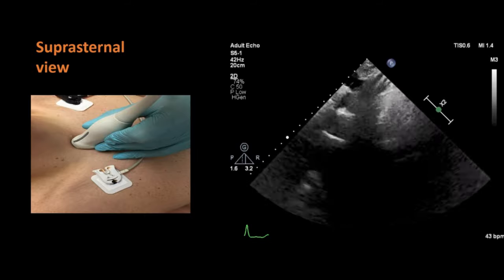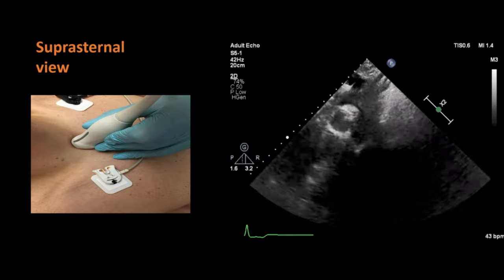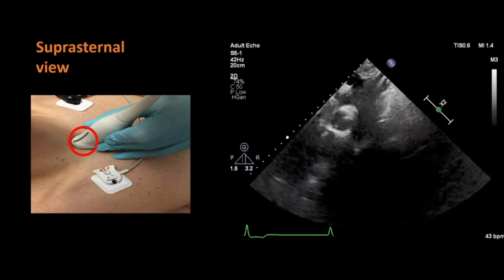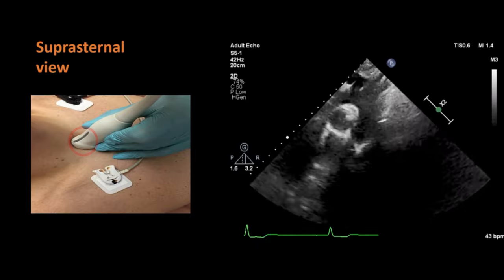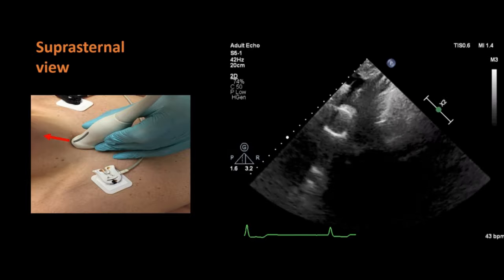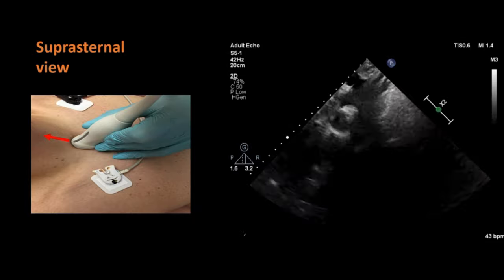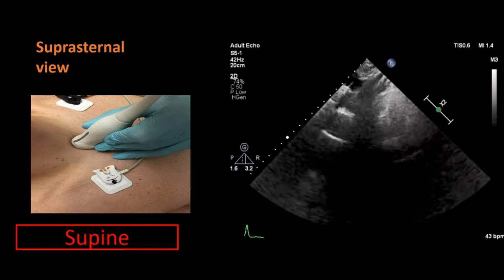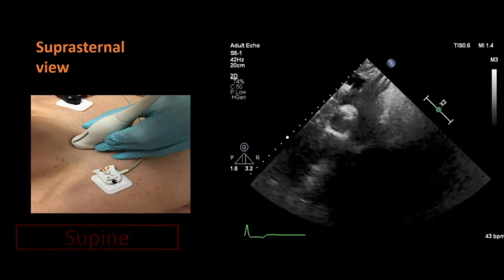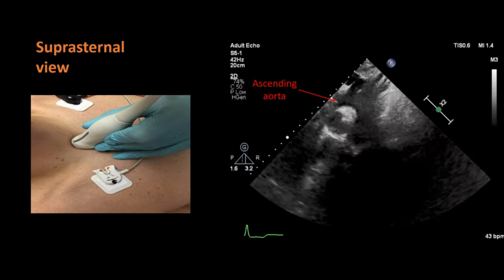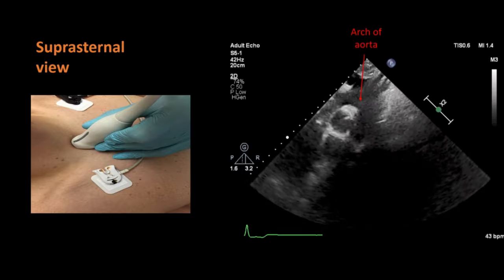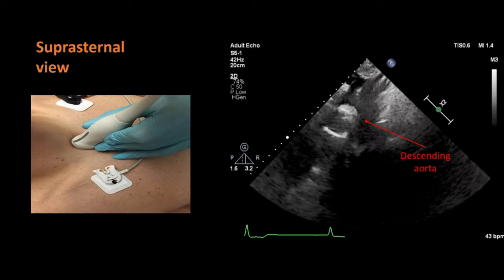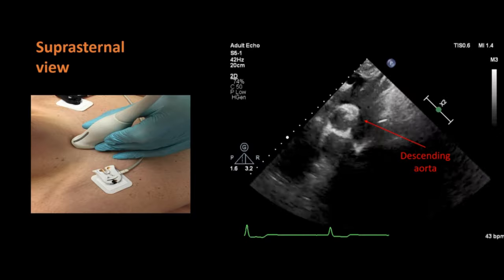For the suprasternal view, the transducer probe is placed in the suprasternal area, just above the superior margin of the manubrium sterni. The orientation marker points superiorly and the patient lies supine. In this view, you can see the ascending aorta, arch of aorta, and descending aorta. You will be able to see coarctation of aorta in this view if it is present.